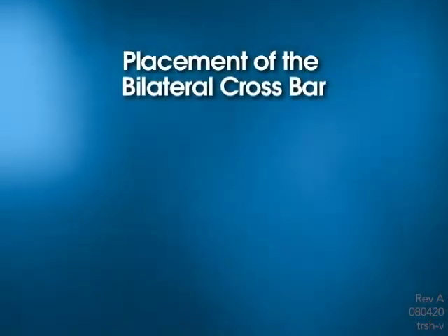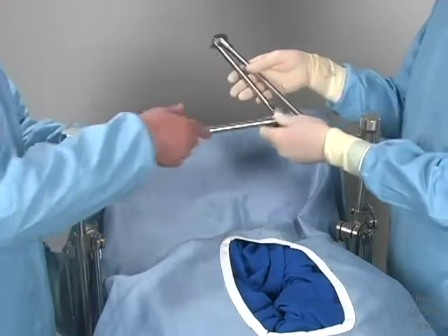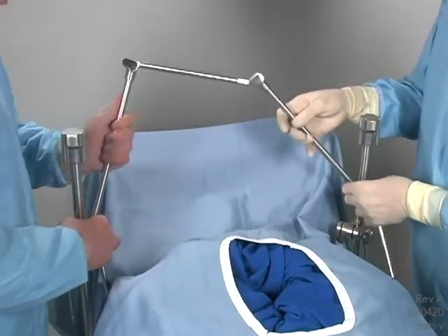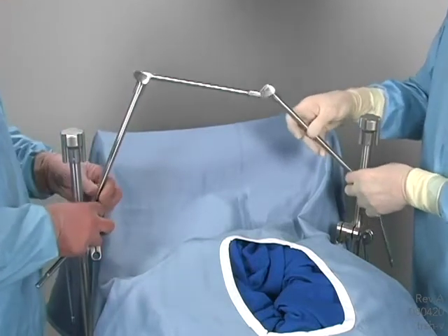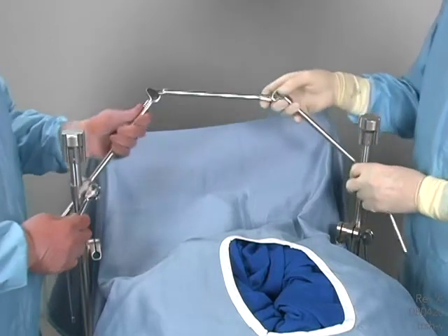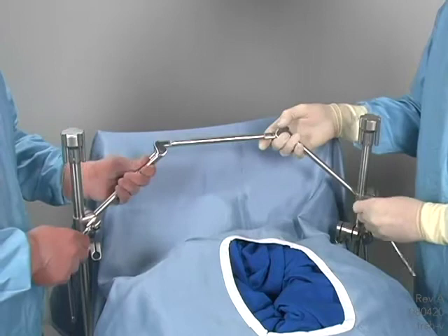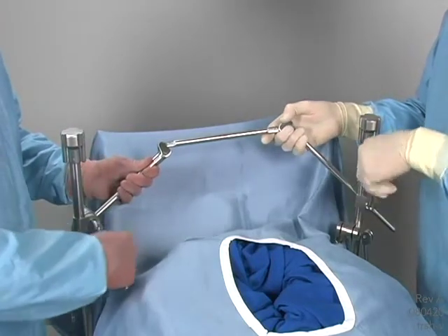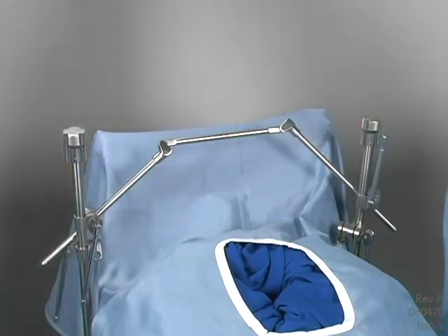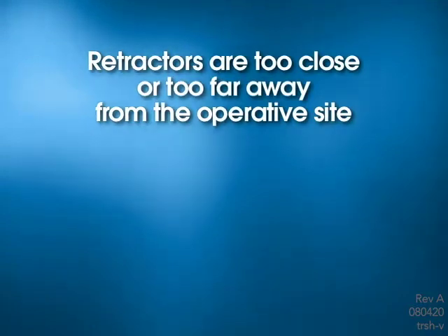Placement of the bilateral crossbar. Placing the bilateral crossbar too close or too far from the operative site can make retraction difficult. A general guideline for placement is 6 to 8 inches away from the incision. To adjust the position of the bilateral crossbar, relax the tension or remove any retractors in place. You and your assistant simultaneously grasp the bilateral crossbar, release the cam joints on the rail clamps, reposition, and lock into place.